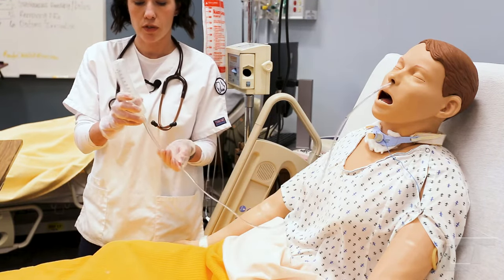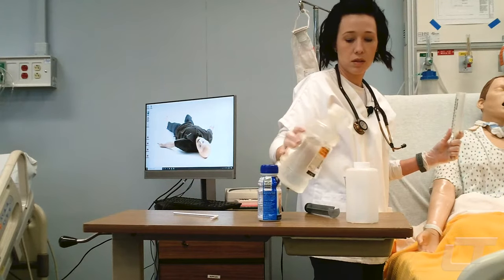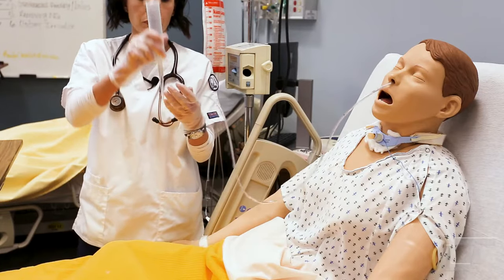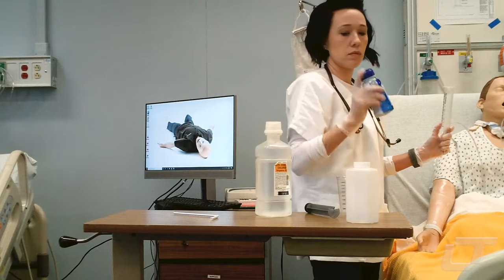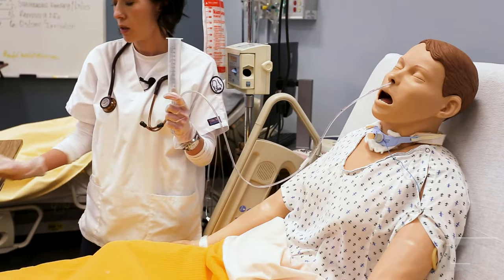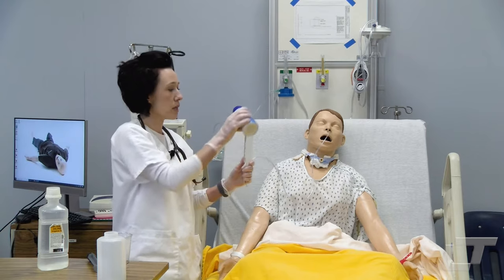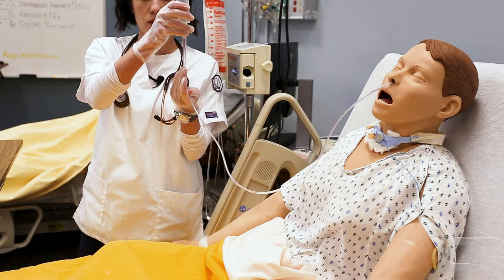This formula has already been checked for compatibility with the patient's meds. We'll start with putting in some 30 milliliters of water to flush the tube. And then we would slowly work by putting the formula through the tube as well. This whole process would take about five or ten minutes.